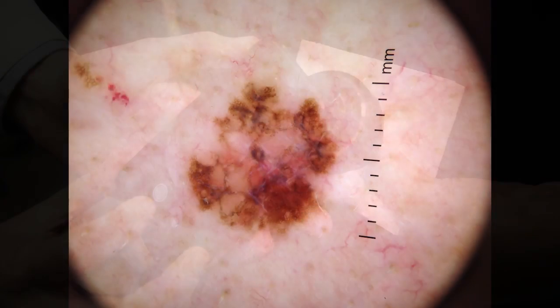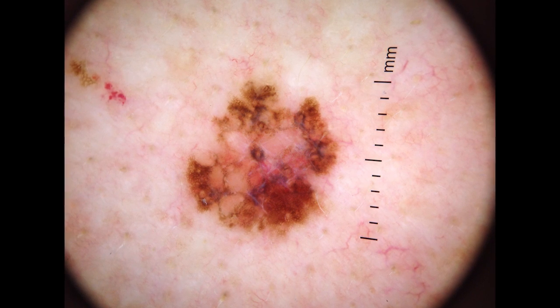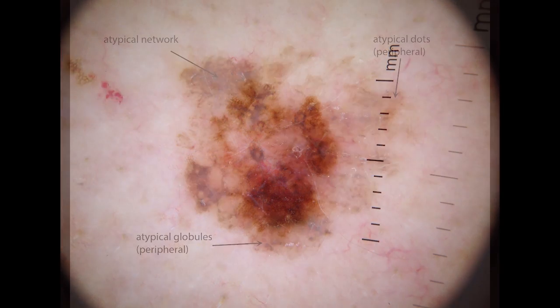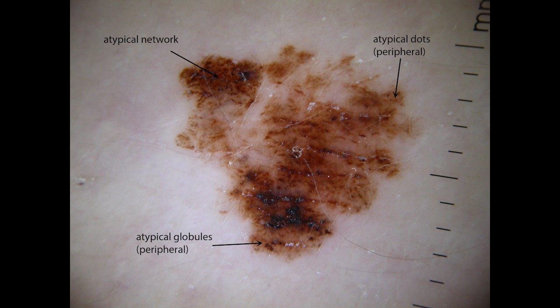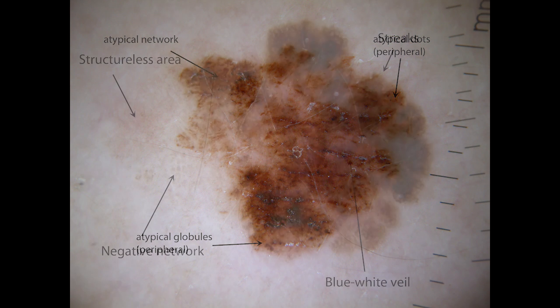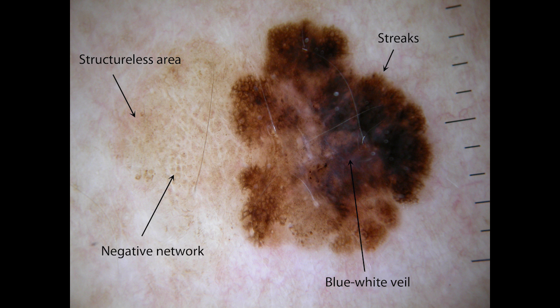Here are some examples of melanomas seen through a dermatoscope. This melanoma shows an atypical network with some atypical dots and atypical globules, both at the periphery. In this melanoma, you can see structureless areas, negative network, streaks, and a blue-white veil.